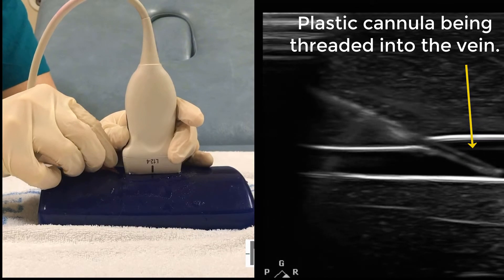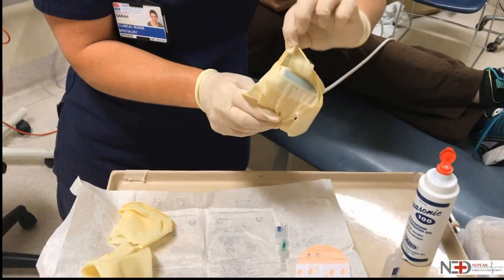Now all we have to do is flush and secure the cannula. So there you have it — the sterile glove technique: a simple and practical way to insert a peripheral IV cannula under ultrasound guidance. We hope you enjoyed the video and found it useful.